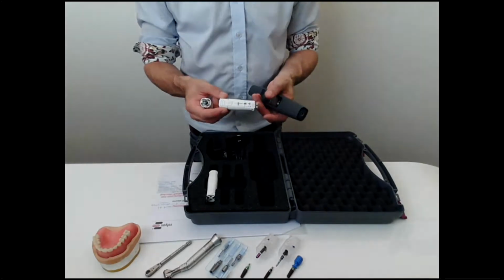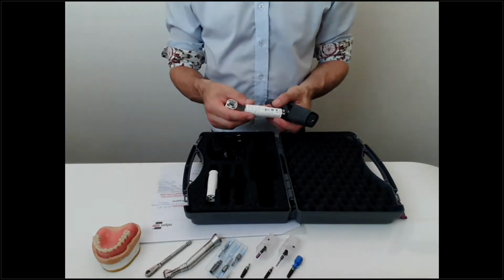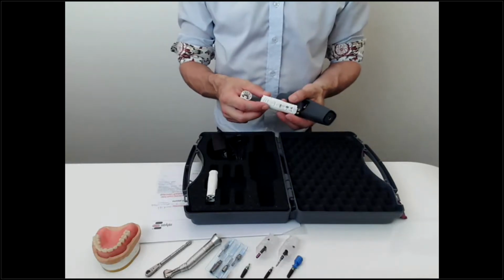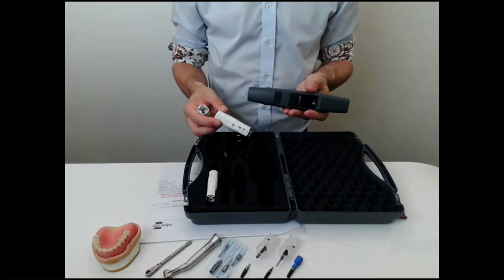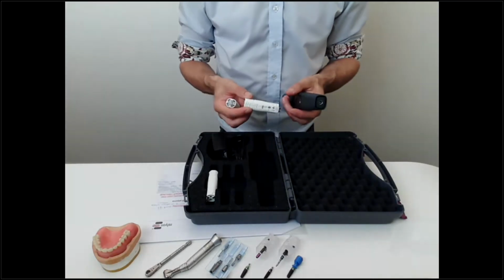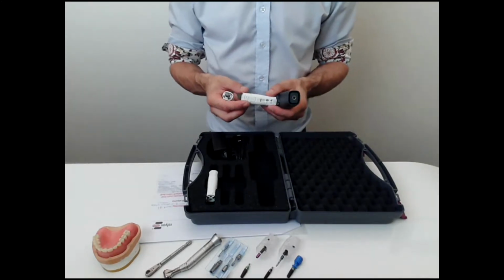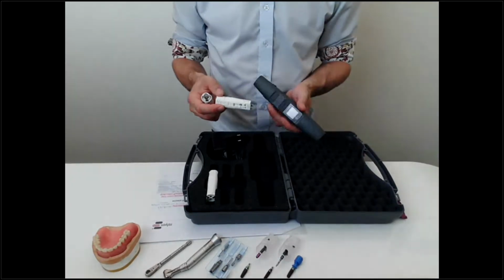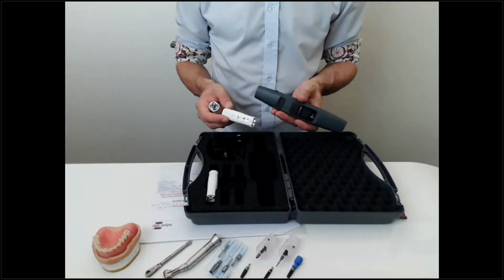We also know from the dental lab colleagues that they very often have hybrid materials. So then you can adjust the software in your device, and then it will also accept the hybrid materials in somehow limited power mode, so it should not destroy the device.